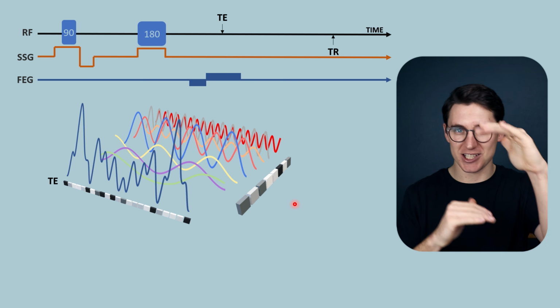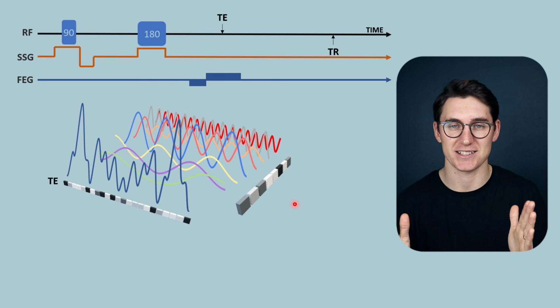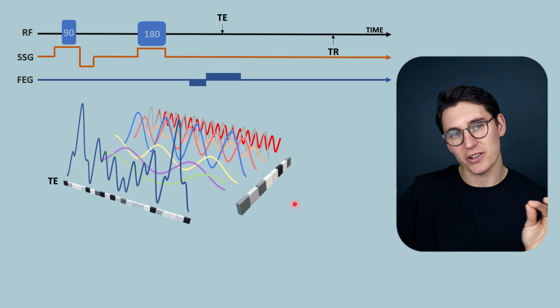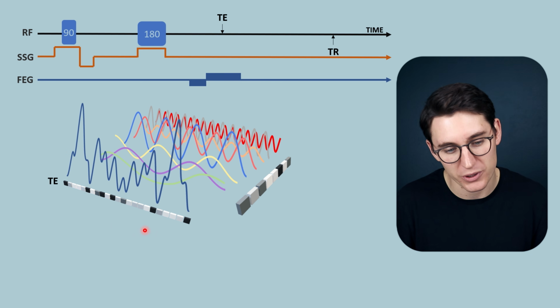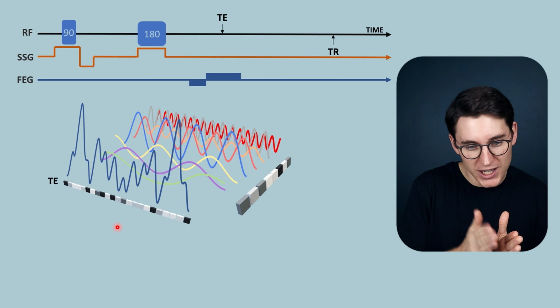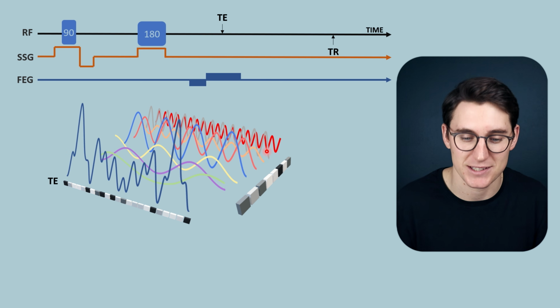Now, when we've been looking at the specific slice in my example, I only had 8 different net magnetization spins along the x-axis. In reality, there's an infinite amount, or infinite variation, of frequencies as we head along that x-axis. And it turns out that the number of times that we sample the signal determines the amount of frequencies that we can delineate in our sample. The more times that we sample this complex signal, the more separate frequencies we can get along our x-axis here.